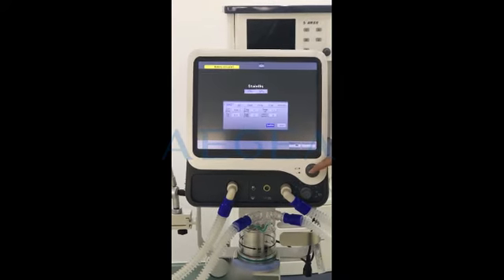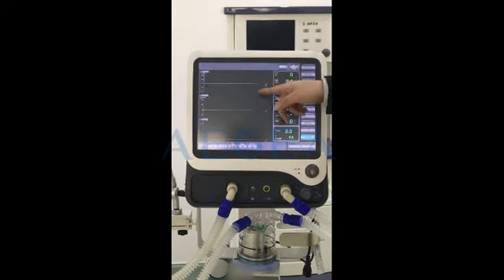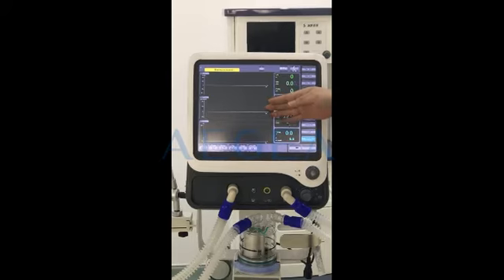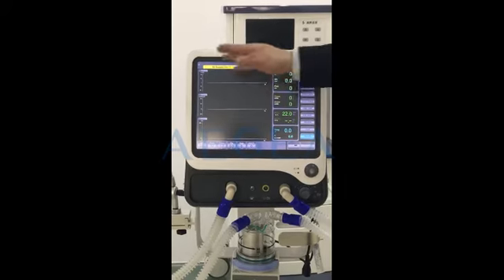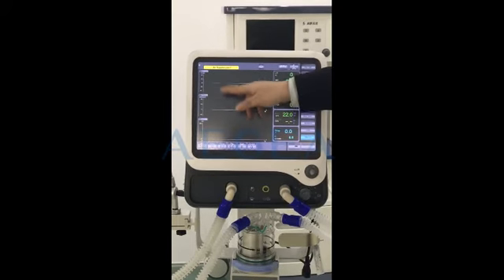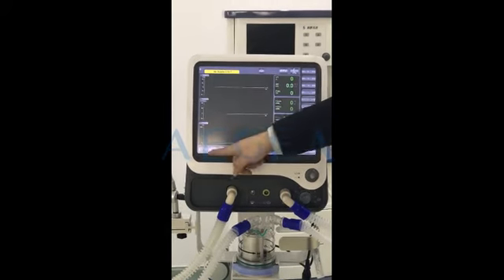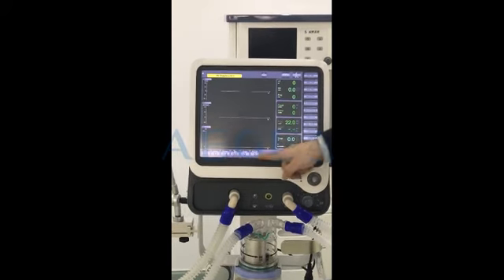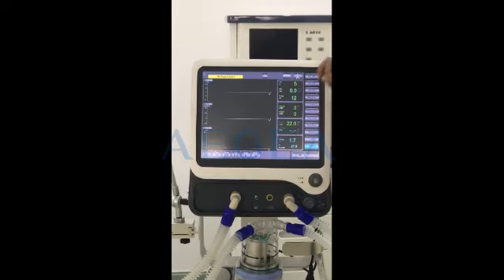Then we enter into the main interface. You can see here we have four parts: the alarming function, waveform, monitoring parameters, and the setting parameters.